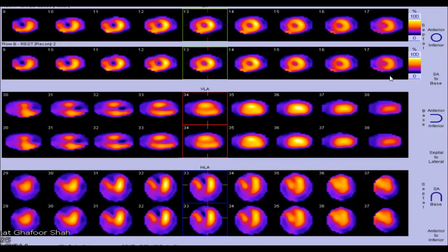That's also a partial perfusion defect. If these belong to the same vessel, what do you think? Do the defects you are seeing in this scan belong to the same vessel territory or a different one?